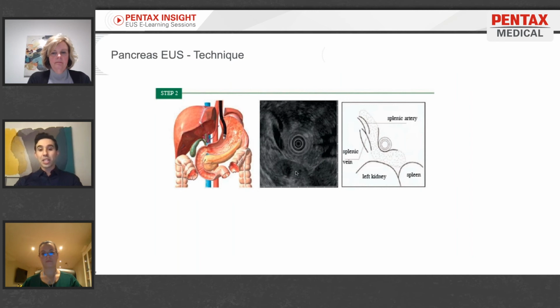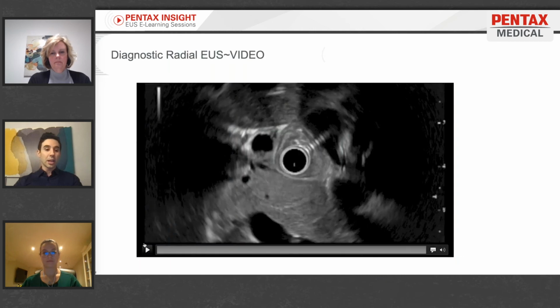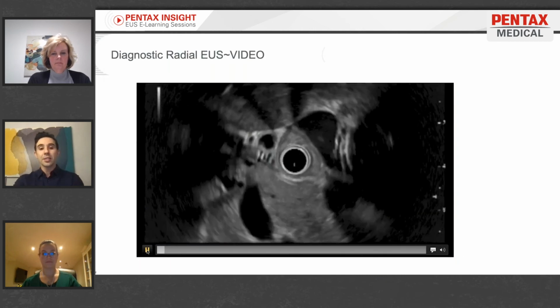So it is much easier to find spleens and kidneys sometimes than the small pancreatic tail, and I'll use my vascular structures to find the pancreas first, and then go find these other important organs and track the pancreas in between them. And so again, a short video to highlight this.